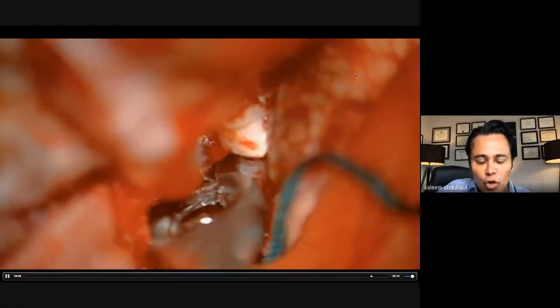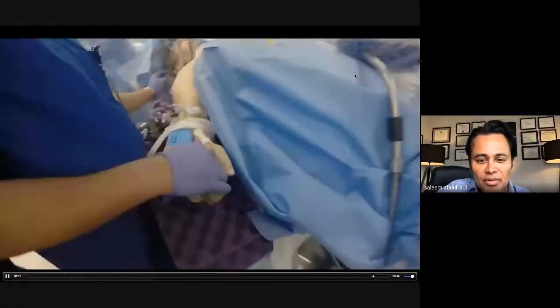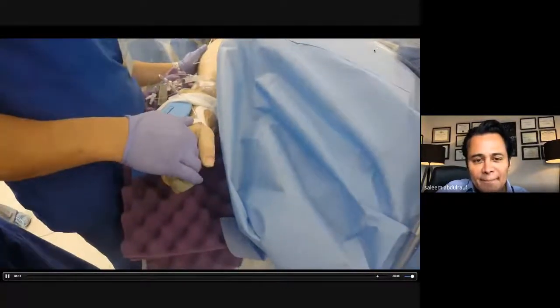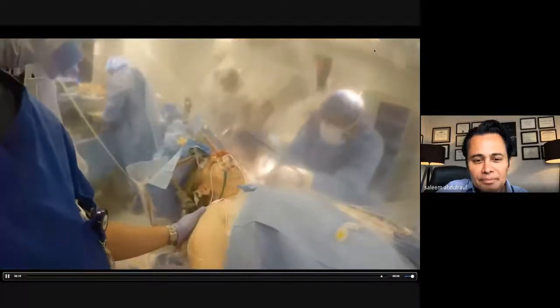I make sure I get the whole neck since we did so much work. Squeeze my hand one more time. Squeeze tight, tight. Good. Let go. Perfect. Your aneurysm is taken care of. It's all cured, okay? Now you get to sleep while we do the closure.